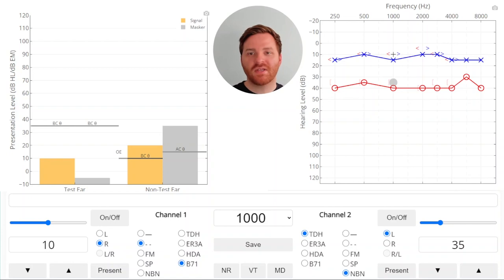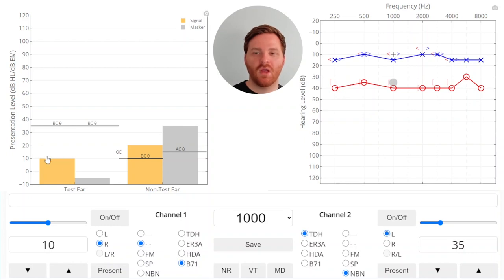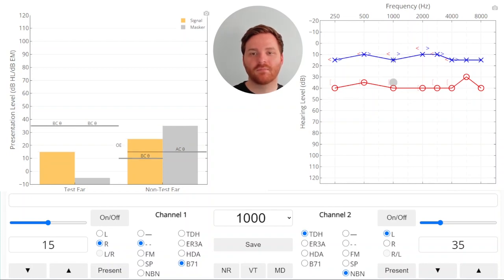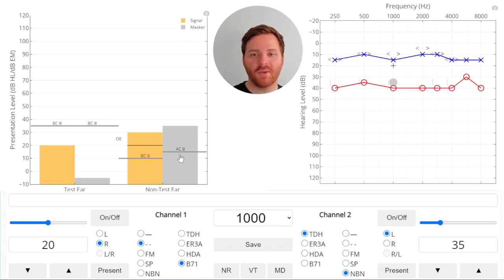At this point, we'll present our stimulus and we won't get a response, and this makes sense. Look at the masking tool — our stimulus is below the threshold in the test ear, and it's above the threshold in the non-test ear, but we've put enough masking in to make sure that we're covering up that signal. At this point, we would raise our signal. No response, so we raise our signal again. We got a response. Let's take a look at what's going on here in greater detail. The signal is presented at 20 dB into the test ear — we're below the threshold in that ear, but the patient responded, so we're not getting a response from the test ear.